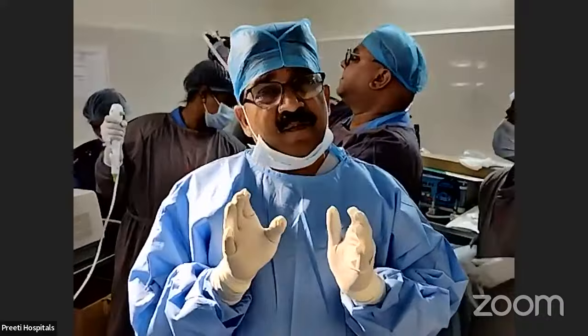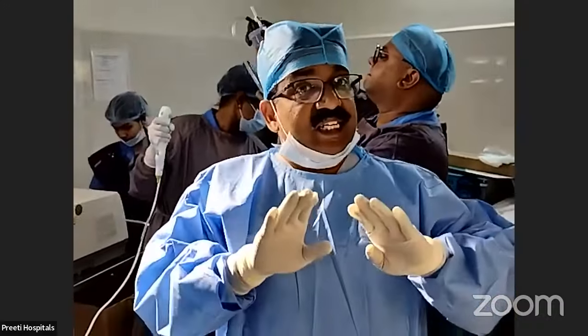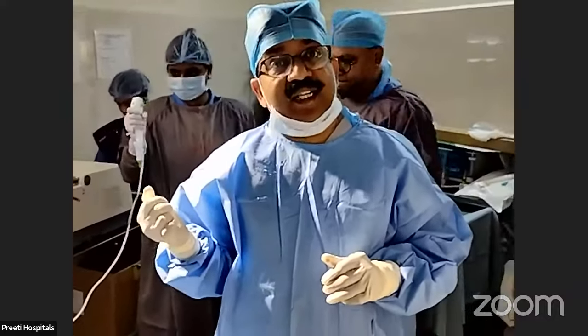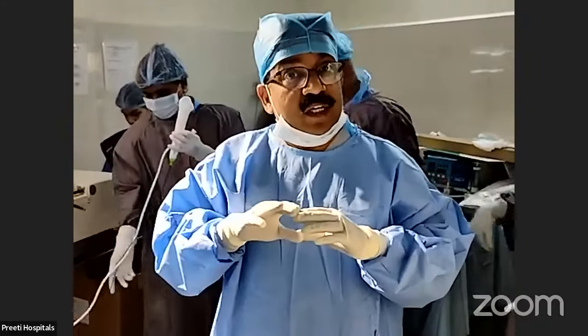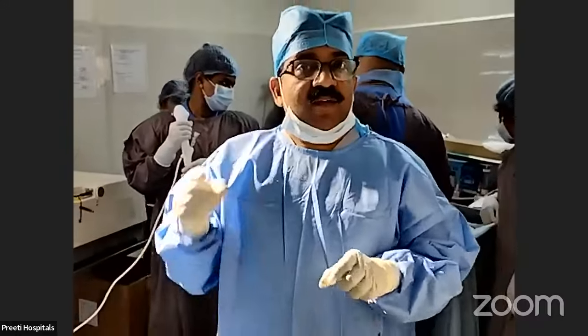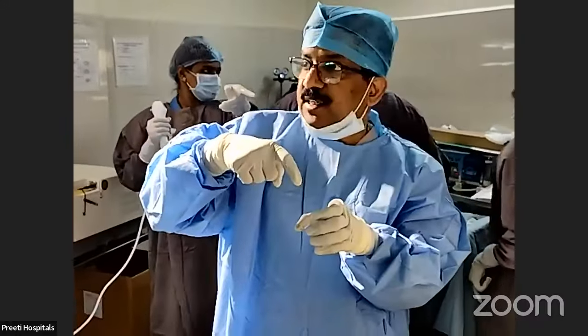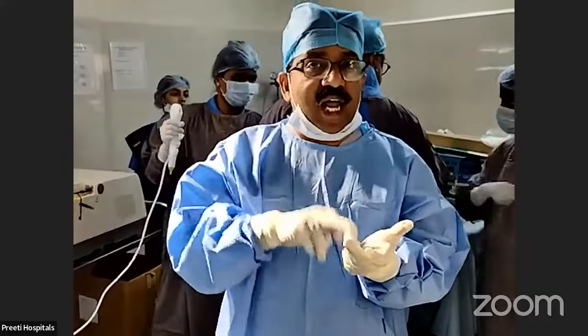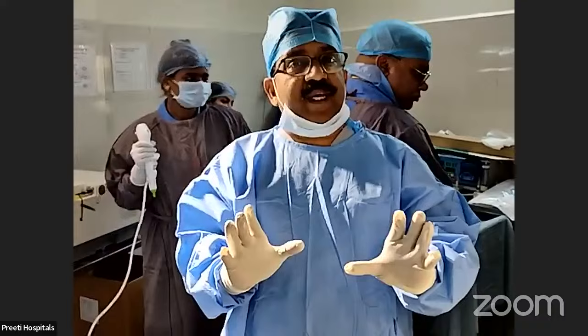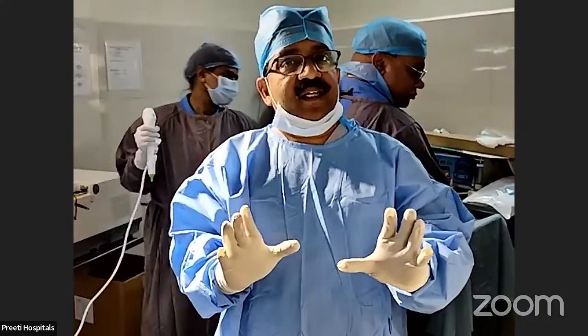RIRS with a flexible sheath. Whether it is navigable or not is doubtful. Navigable means sometimes the control is outside the sheath, previously without the scope. But still, this is also navigable. Why? When the scope is there, you are navigating it. So, FANS only. Flexible, accessible, navigable sheath. That means the size is big. The day the size comes down, now this scope is already 7.3. That's why the fragments are coming out so nicely.